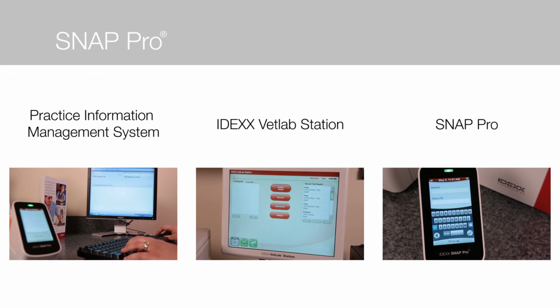If the snap test run was started at the Practice Information Management System, once you select the checkmark, the results will then be sent back and stored in your Practice Information Management System. If the snap test run was started at the IDEX Vet Lab Station, once you select the checkmark, the results will be sent back and stored in the IDEX Vet Lab Station. If your snap test run was started directly on the Snap Pro, once you select the checkmark, the results will be stored on your Snap Pro. The last 100 snap test results will be available to be viewed on the Snap Pro Results tab.